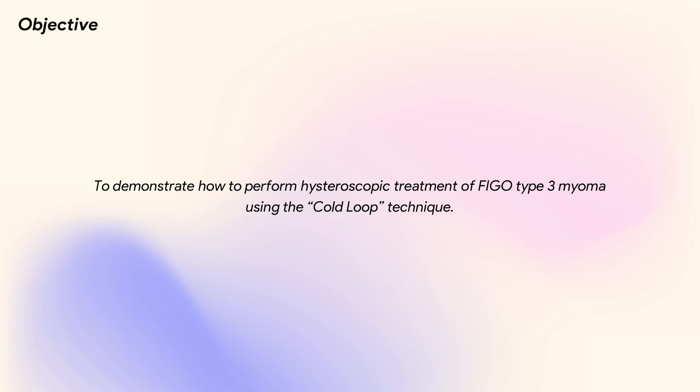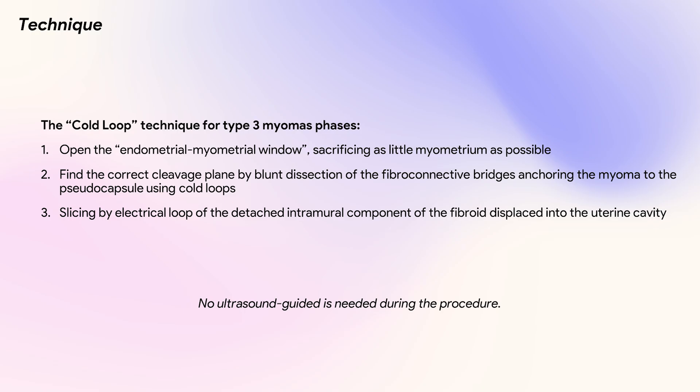In this video, we demonstrate a step-by-step hysteroscopic treatment of FIGO type 3 myoma using the cold-loop technique. The cold-loop hysteroscopic myomectomy is articulated in three phases: one, open the endometrial-myometrial window, sacrificing as little myometrium as possible; two, find the correct cleavage plane by blunt dissection of the fiber connective bridges anchoring the myoma to the pseudo-capsule using cold loops; three, slicing by electrical loop of the detached intramural component of the fibroid displaced into the uterine cavity. No ultrasound guidance is needed during the procedure.